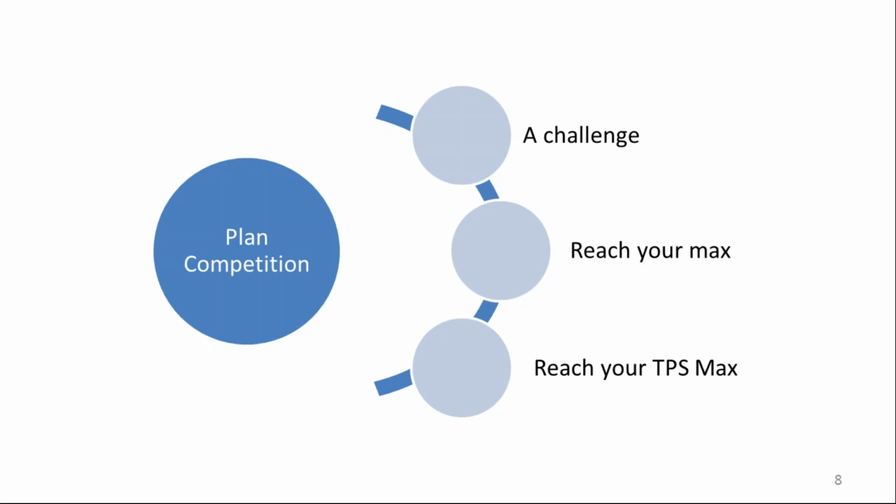The plan competition is a challenge that can push planners worldwide to the max, and also push their treatment planning system to the max. Through this challenge, you will be able to identify the limits of your treatment planning system and also the limits of your knowledge, which may need to be improved.